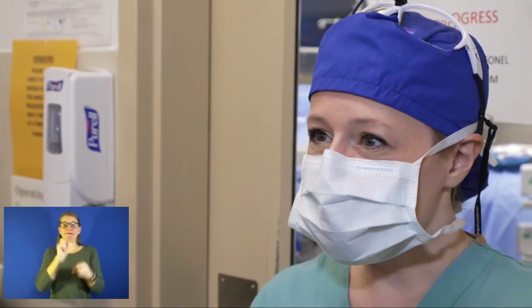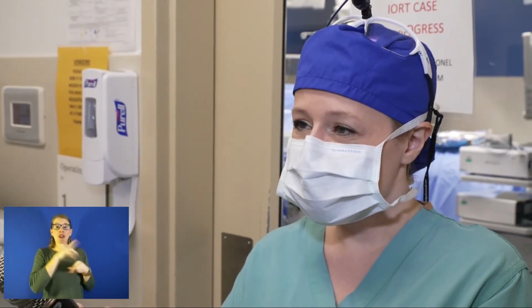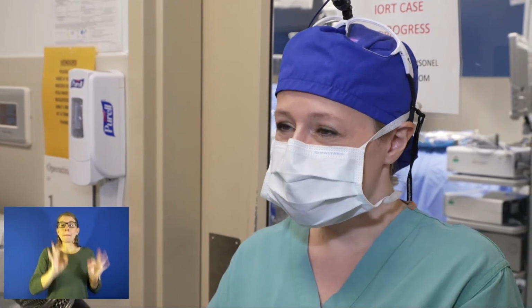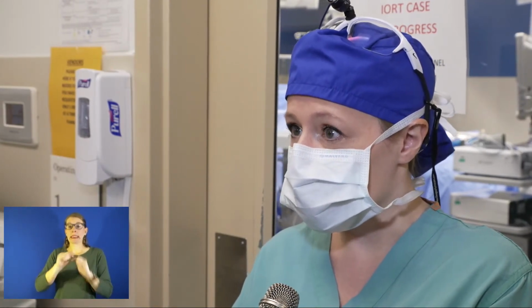When we talk about catching cancer early and that being the ideal patient for the IORT procedure, early as in the smaller the tumor, the better for the patient and for this therapy? Yes, exactly. The treatment has a specific anatomic cutoff because we have certain applicators in certain sizes. There are rules and restrictions for what we can do and how we can accommodate this. So people have to have a small early stage breast cancer to get this treatment. So what happens next? Yeah, this is a team-based effort. While I was performing the operation, our radiation oncology colleagues were out here preparing the equipment.